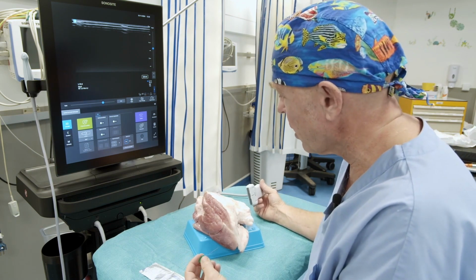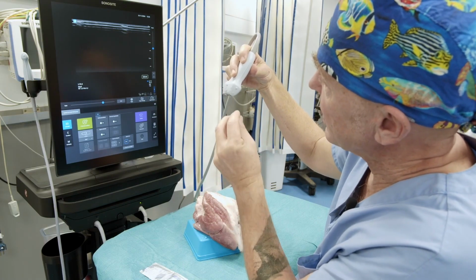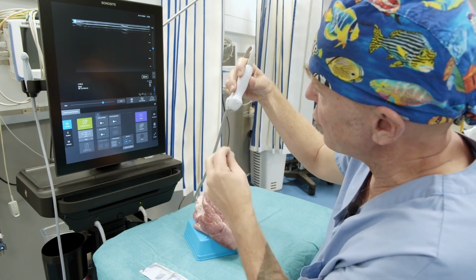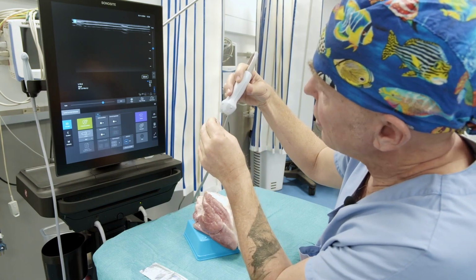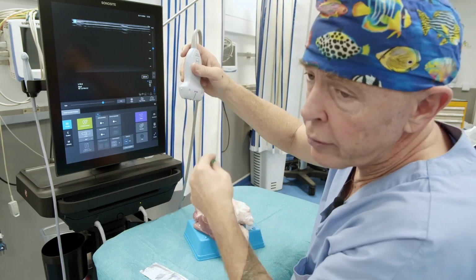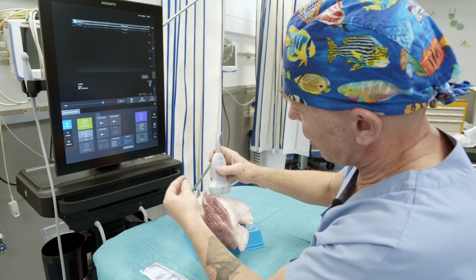to visualize your needle. Additionally, it is essential to comprehend that when you slightly tilt the probe to obtain the best possible image, you should avoid puncturing directly in the center. Instead, make a slight shift, as the ultrasound functions in such a way that the maximum signal is concentrated in the center. Therefore, you will need to make a slight adjustment to the puncture point to achieve a perfect visualization of your needle. The other notion is the greater the angle, the less you will see the needle. Beyond 40 degrees, you will completely lose sight of the needle. So that's a bit of the problem when you are doing, for example, deep blocks.